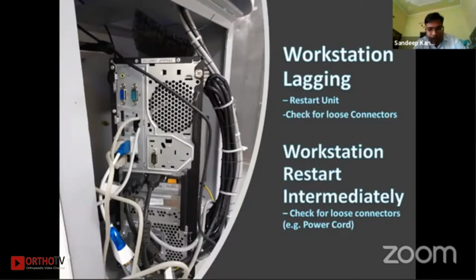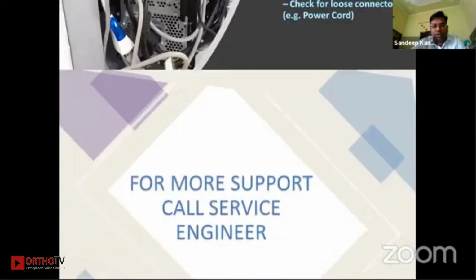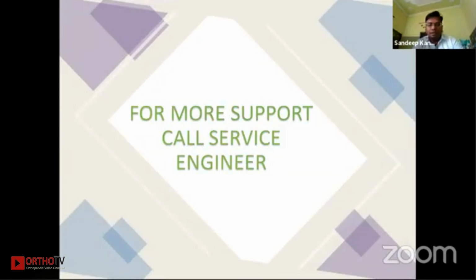That is basically related to the power supply between the unit and the main supply. So we initially check the power cord, sir. If the same problem persists, then we call the service engineers. They will help, sir.